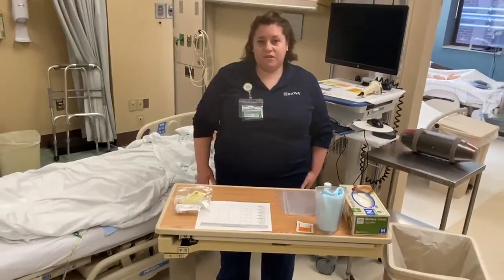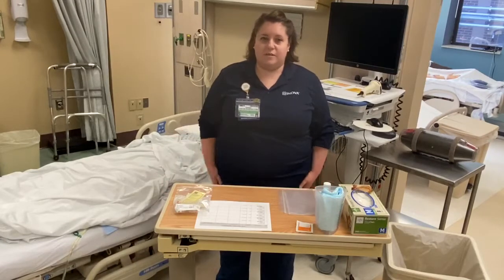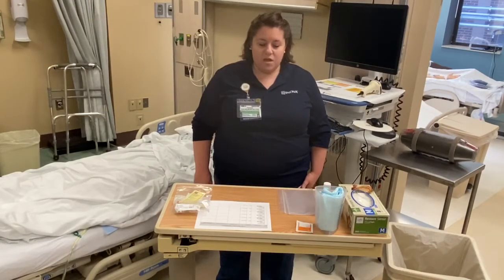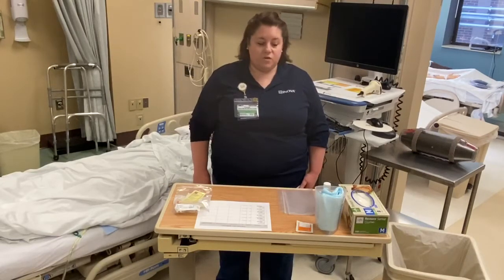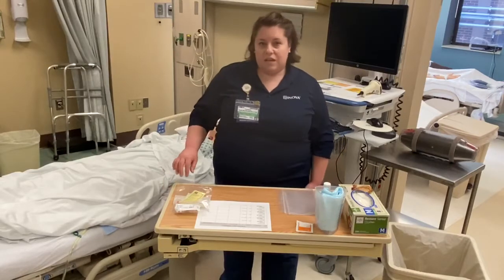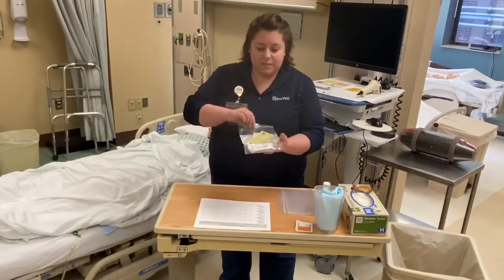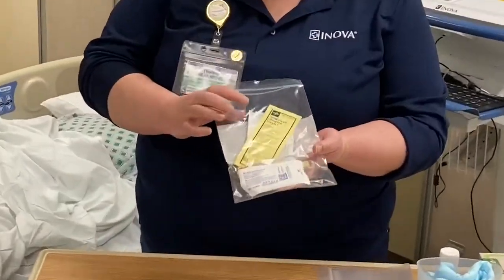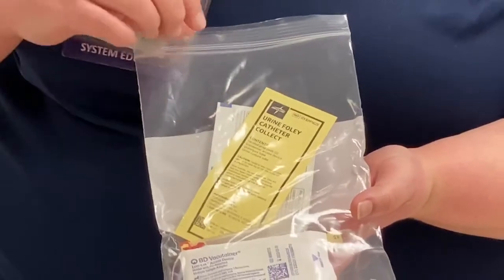Like with any procedure, your nurse is going to delegate to you the task of getting the specimen from the Foley catheter. So my nurse has asked me to get a specimen from my patient, so I've gone to the supply room to gather my supplies. The things that you'll need for the specimen from the indwelling Foley catheter is this specimen collection kit. It actually says urine Foley catheter collect right here on the bag.